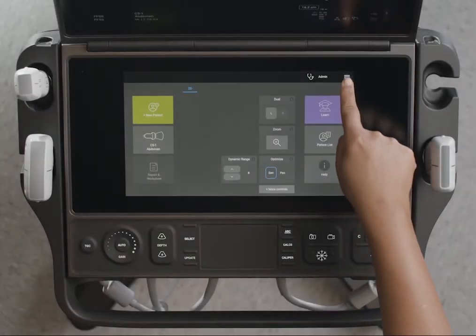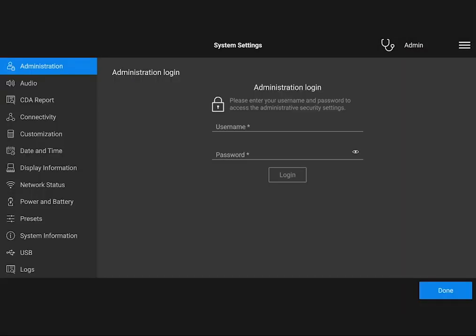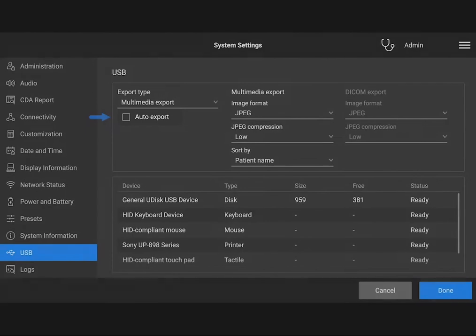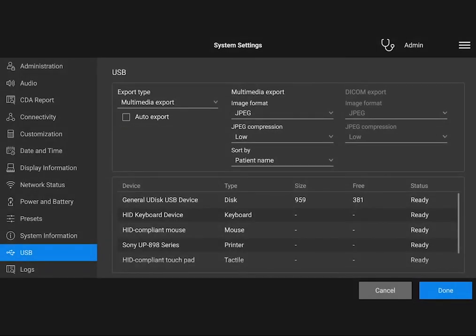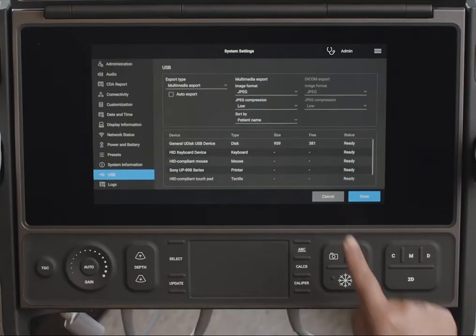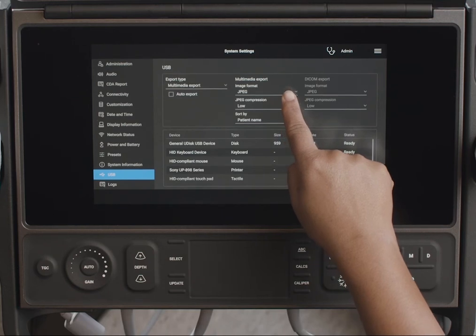Now, choose your USB device preferences. You can choose to automate USB export or do it manually. For this video, we're going to do it manually. Choose the format you would like your images to be exported in, such as JPEG.